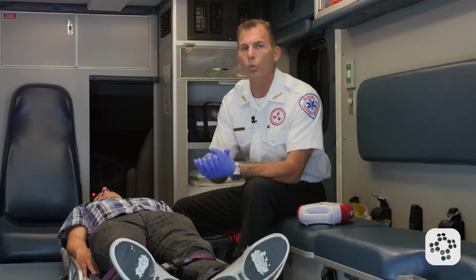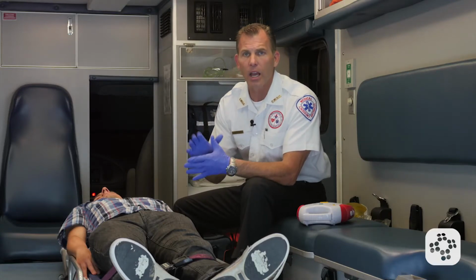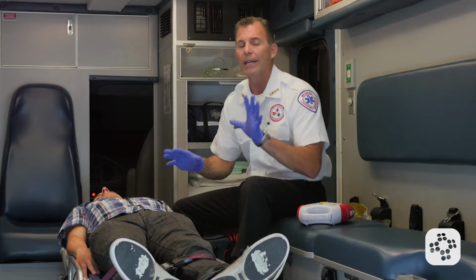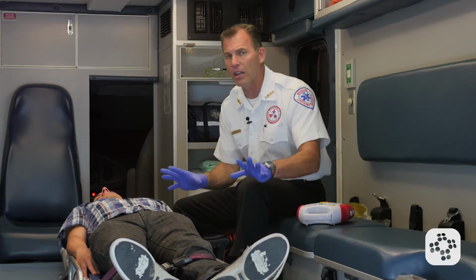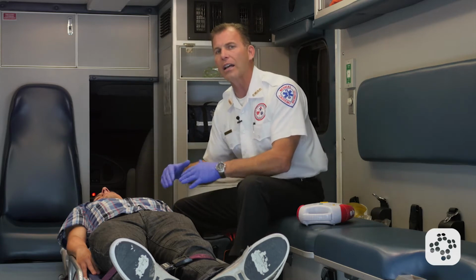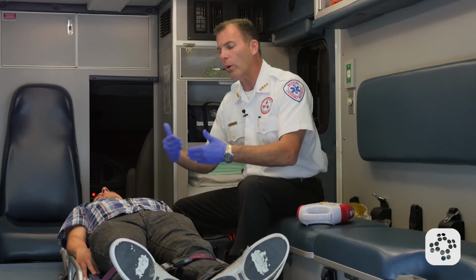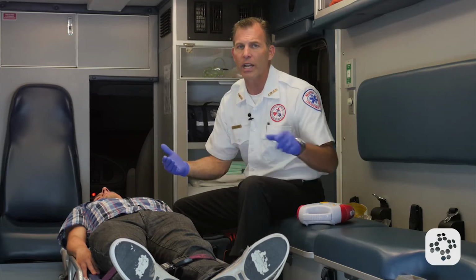Some people have asked, what if they're a drowning victim? Is it okay for them to be in wet clothing as long as the chest is dry? Yes, it is. They can stay in their wet clothes as long as they're not lying in a pool of water or submerged in the water, so that we're not connected to each other when I defibrillate.